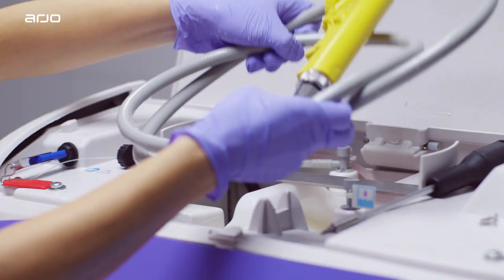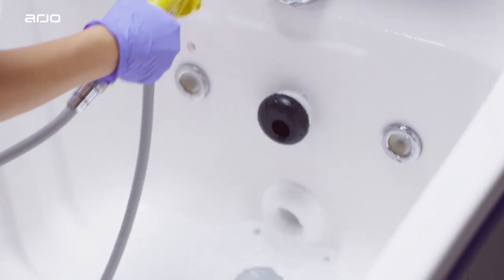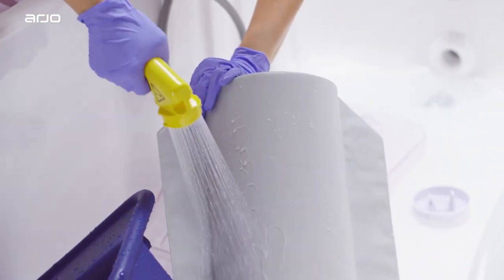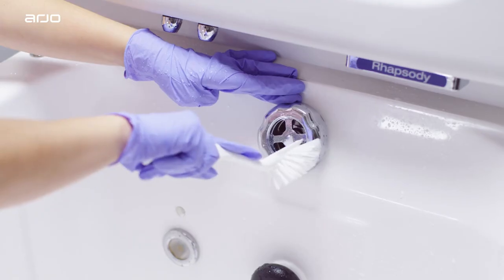To begin the full disinfection of the bath, take out the yellow handheld disinfection spray from the service compartment. You may now apply disinfectant to all surfaces of the bath. Scrub all surfaces with a brush while the disinfectant activates.